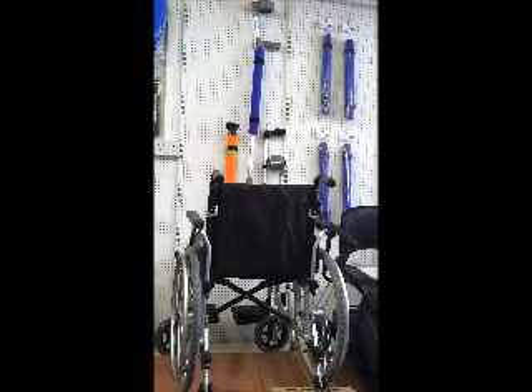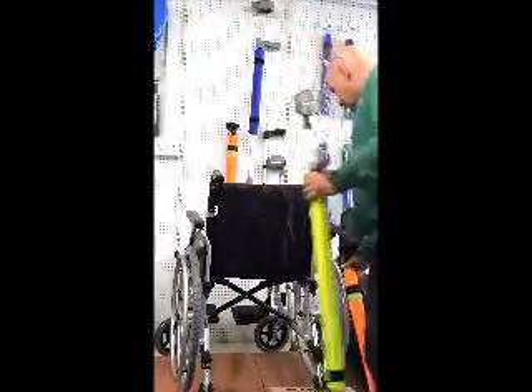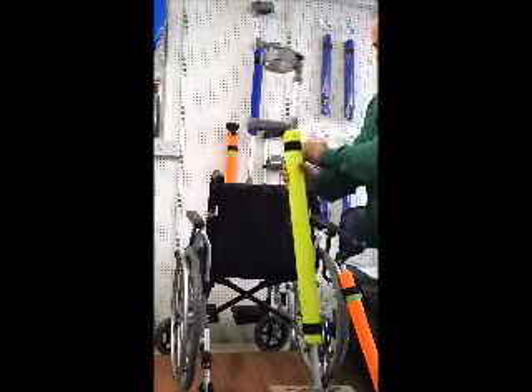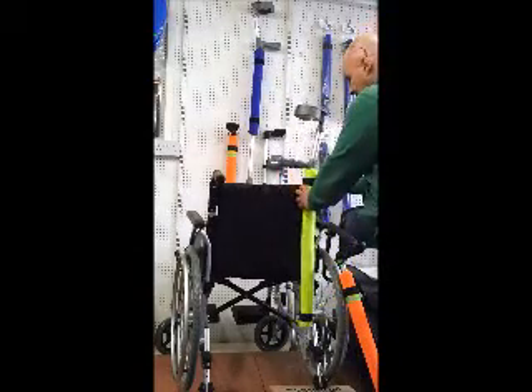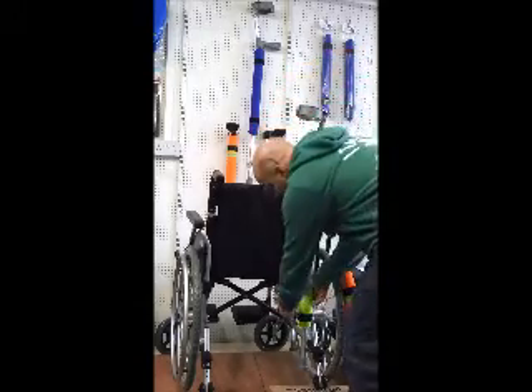How to attach a walking stick or crutch with the paddle pad onto the back of a wheelchair. Take your walking stick or crutch and approach your chair. Undo the velcro at the top and wrap it round the handle. This then attaches back to the velcro and that is now attached.